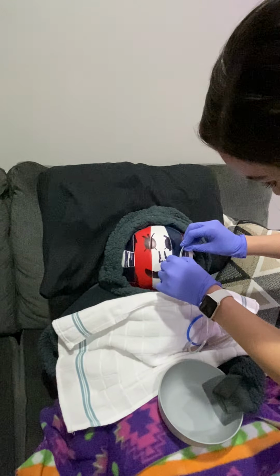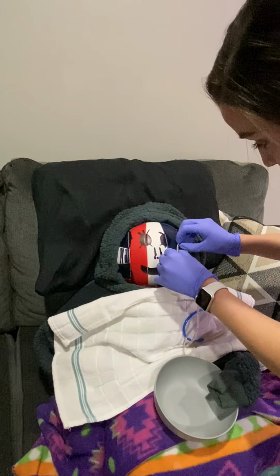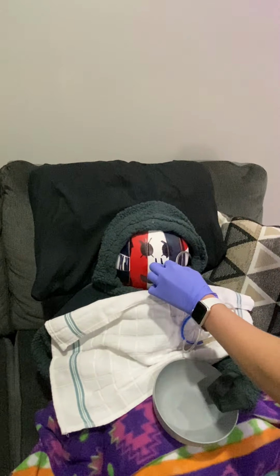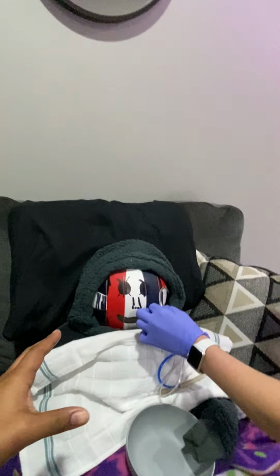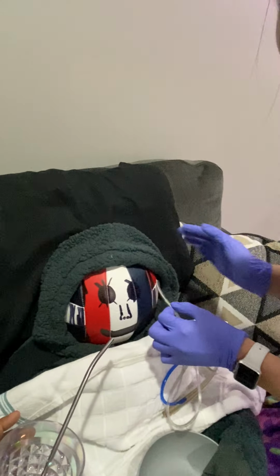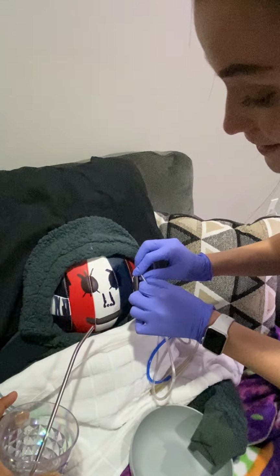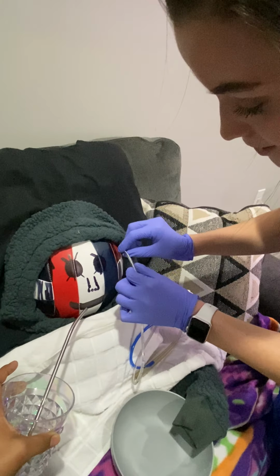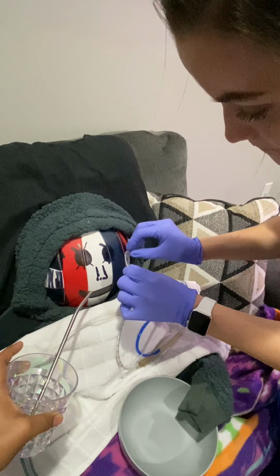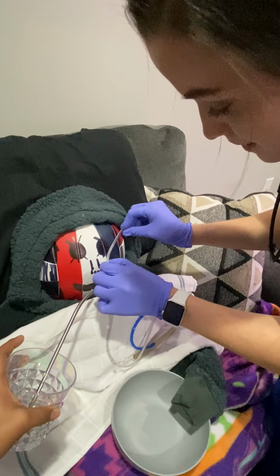All right. So she should be coughing, and then once I make it past the oropharynx, I'm going to have her tilt her head forward, and that's where my help is going to come in handy. All right. So I'm going to also emphasize the need to mouth breathe during this. All right, so you'll take a drink, and as she swallows, I will further insert the tube. Swallowing, okay. So we have made it to our line.